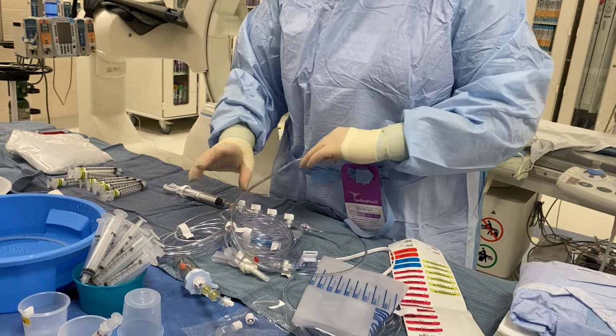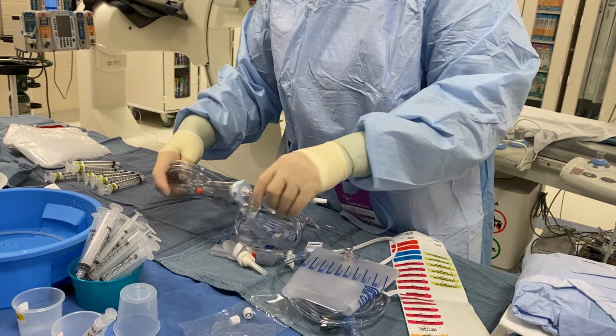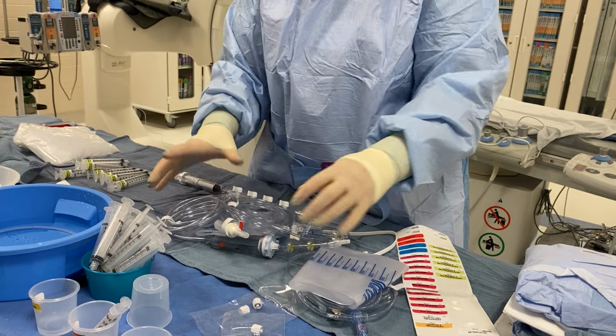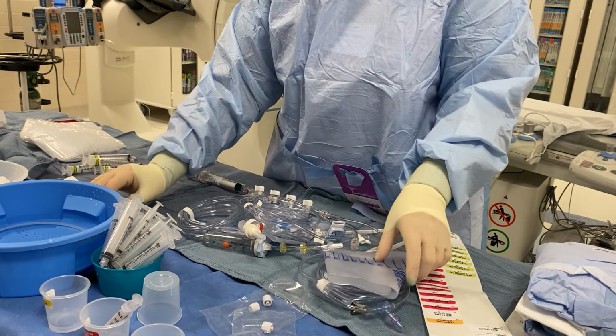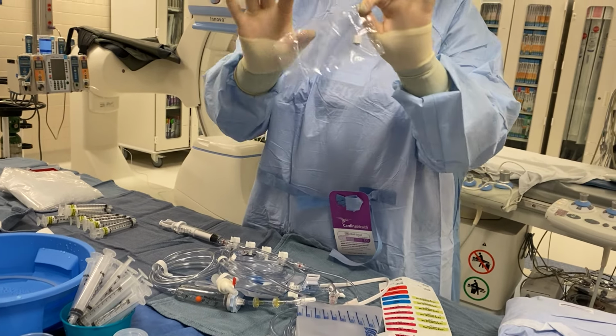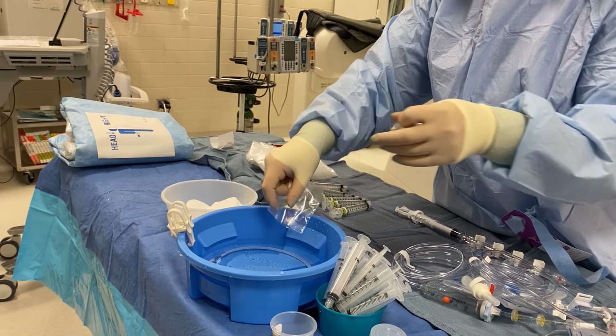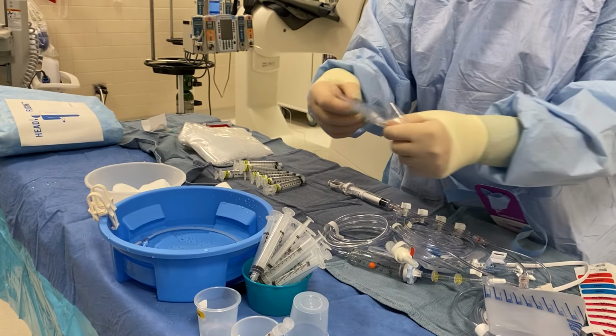And then I just like to have everything wrapped up nice and neatly so that when it comes time to drape the patient and set up, I can grab everything in one handful. And then sometimes your manifold may come with some of these caps. You can put them wherever you like. I like to just put them right in our bag of saline.